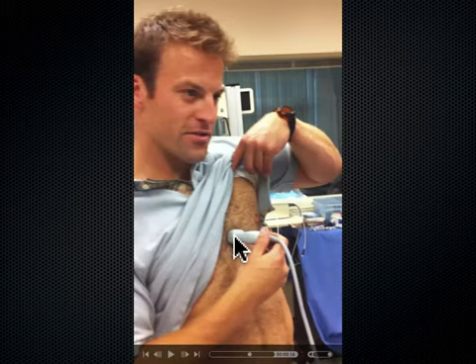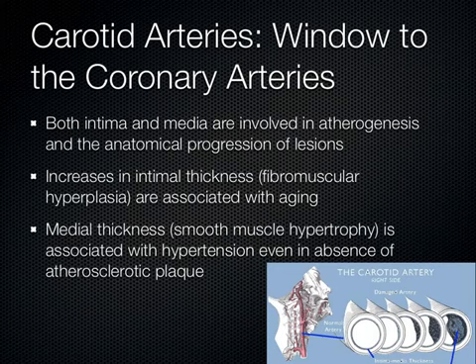This is why when we do this on the patients, we lay them flat and we roll them left lateral decubitus, and that makes the PMI somewhere over here. That's where he'd be putting the probe. But I just wanted to point this out. And he's a really good sport about stuff like that, so I'm sure he wouldn't mind that I stuck that up there. Any questions about that kind of stuff?